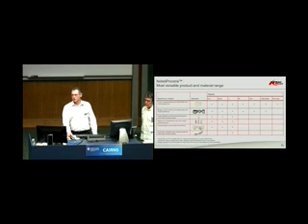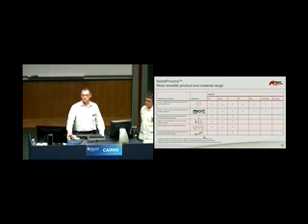These bridges are what we call a PIB, which people commonly know them as. The PIBs are available in zirconia, coloured zirconia and titanium, whereas this next bar down is a virtual designed overdenture bar. So it's designed on the computer, which is distinct from a copy milled PIB bar.